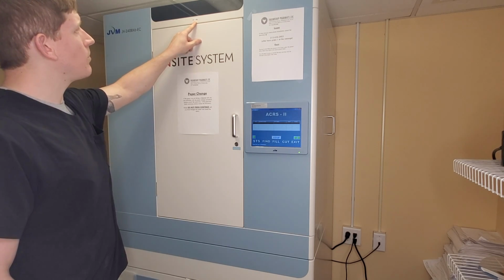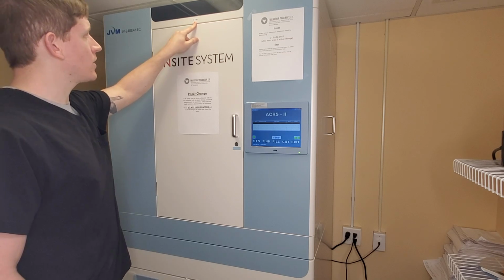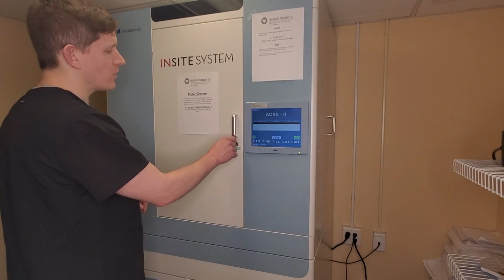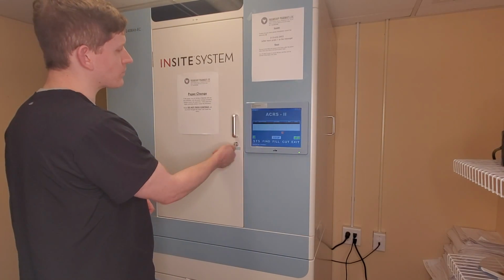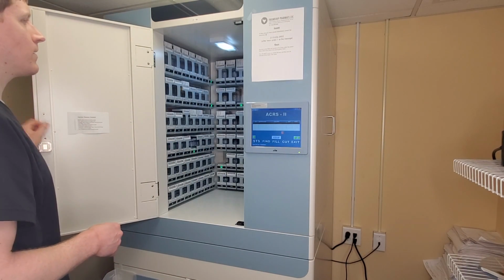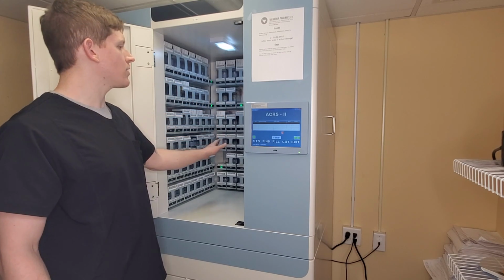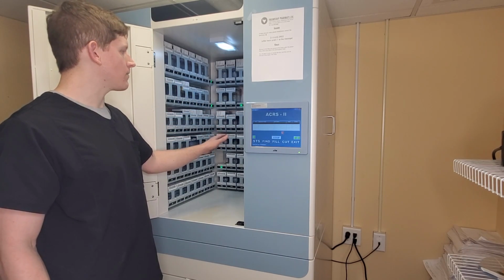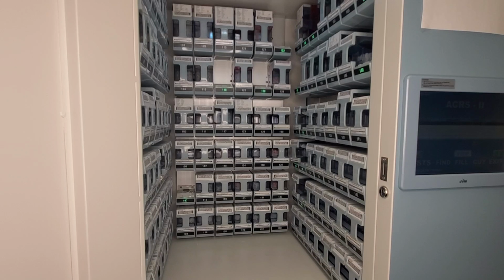Now, once you open the door, you will see that the canisters are numbered descending, and then at the top right corner it begins again. That's how we can find the canister that we need to fix. In this next clip, I will show you how to unjam the canister or fix it if it was jammed. So in this instance, my canister that is troubling me is 178.